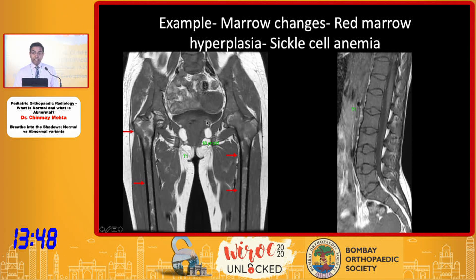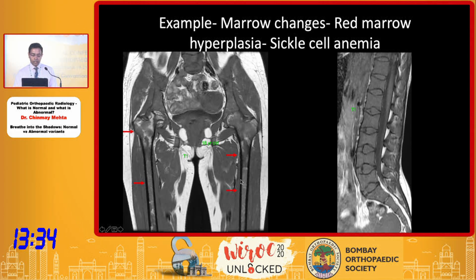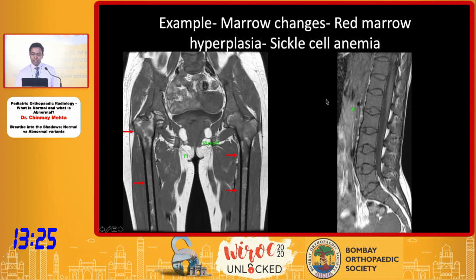Coming to the next example: this is an 18-year-old patient where the fatty marrow is replaced by hypointensity on T1 images. However, this T1 hypointensity is not darker than the muscle — rather it is equivalent or slightly brighter than the adjacent muscle. That is why this is red marrow that has reconverted, replacing the fatty changes. We see this commonly in sickle cell anemia, hemolytic anemia, or stress due to chemotherapy.